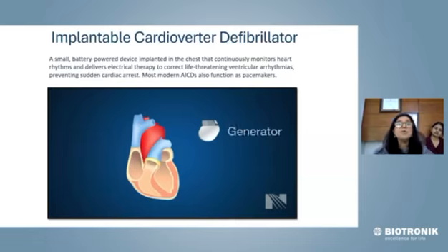With that, we begin into ICDs and typically ICD troubleshooting. Even before I begin, I would like to give you a little historical perspective: ICDs were FDA approved in 1985. It took a very long time for them to be approved, but once approved, there's no looking back. There are no more trials in ischemic cardiomyopathy to tell us whether an ICD is needed, because it has proven itself in terminating arrhythmias and protecting our patients from sudden death.